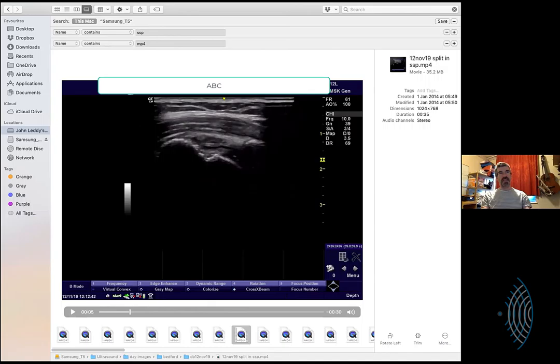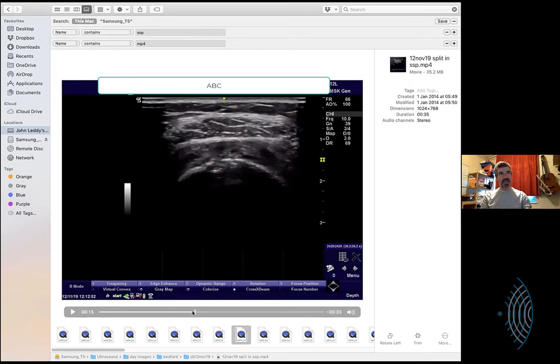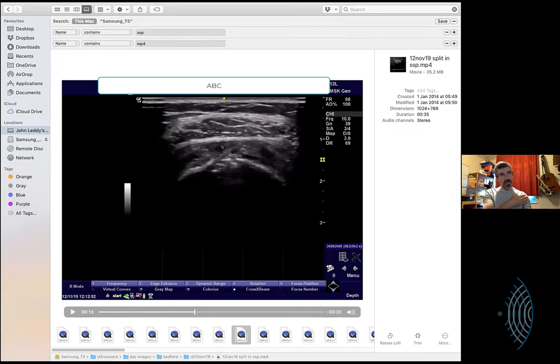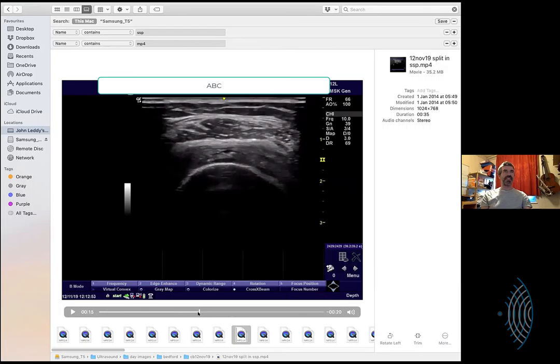So you can see that here you've got long axis on supraspinatus. Quite a short view there, because if I take this back a little bit, you can see the acromion's getting in the way there still. So either their shoulder was very stiff or they're just not. But there's real breakdown here, and the whole thing is broken down, even though the tear is only one short section, it looks like. But when we come into short axis, which we will do in a second, here you see me flick around there, and that looks like a small, flat, rapier-like knife cut through the tendon coming out of here. But you do wonder whether there's actually a breakdown in the tendon at this point as well.